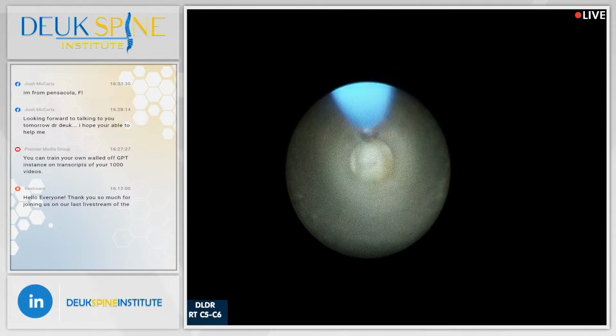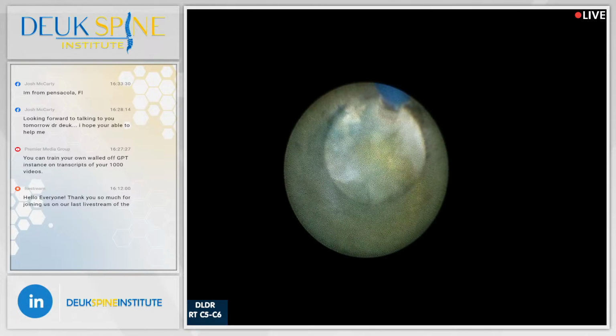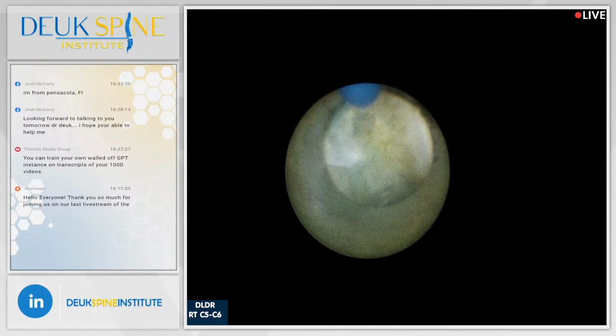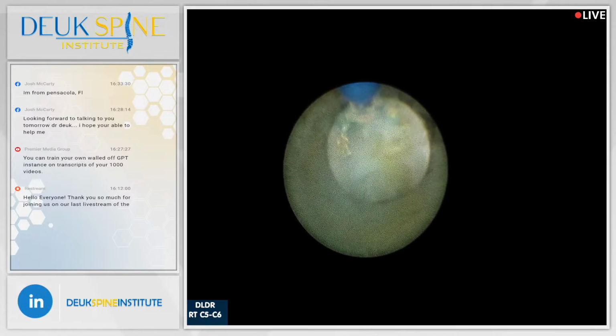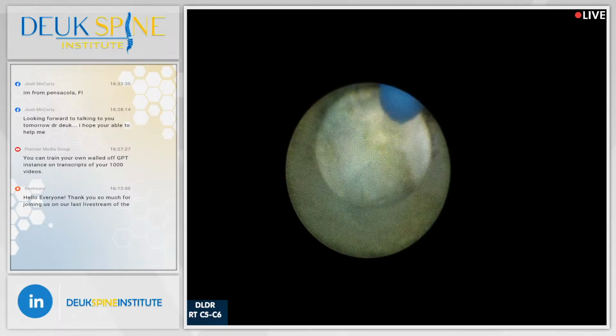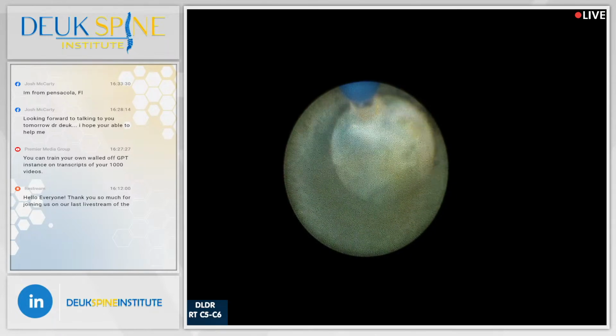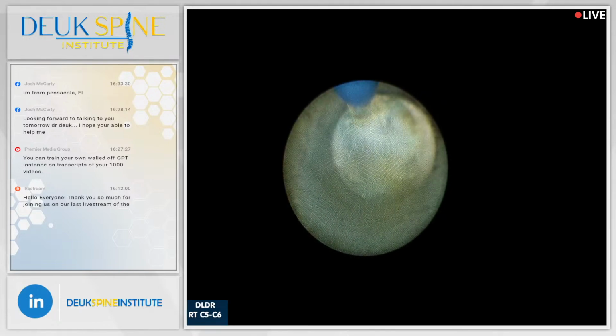All right, any questions for me? No questions. Great, we're just about done, another 2 minutes maybe. You can see the scar tissue over here from the chronic inflammation, and I'm just cleaning as much herniation as I can. Something you should keep in mind, there is no surgeon in the world that can remove 100% of the herniation. The most we get is 80%, average is probably 60%.